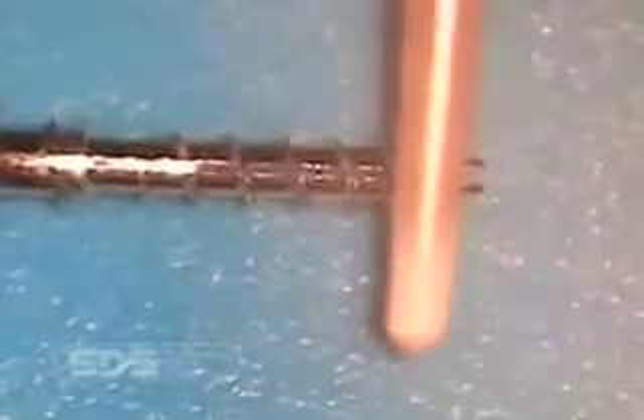Always make sure to try in the post before cutting the apical end. This will cut the threads into the dentin in an atraumatic fashion because we have the full length of the split available to collapse the legs. You can see the debris from the threading of the post — it has accumulated in the split of the post. We remove the debris and adjust the post, cutting the apical end if necessary to ensure full seating of the flange.